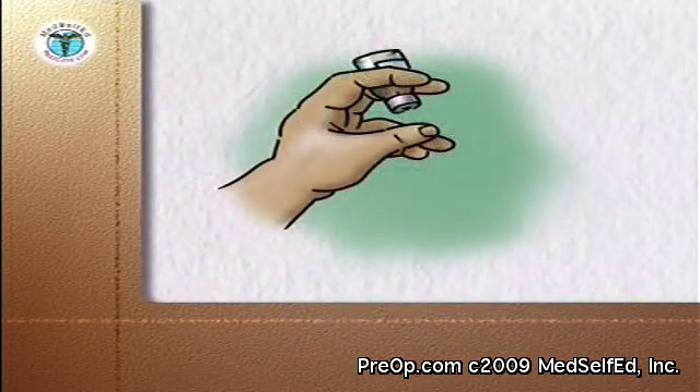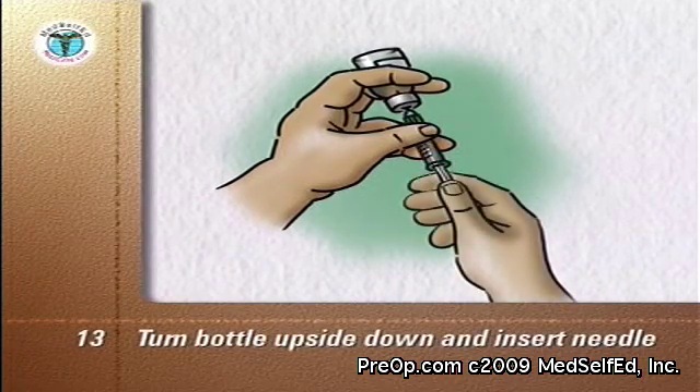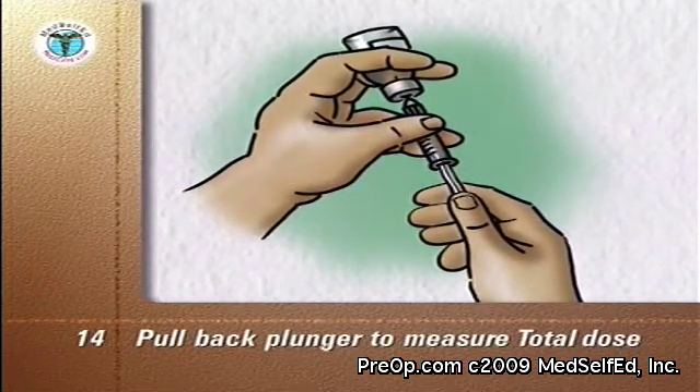Go back to the longer-acting cloudy insulin bottle and turn it upside down. Insert the needle into the liquid and slowly pull back the plunger to measure your total dose — in this example, 25 units.